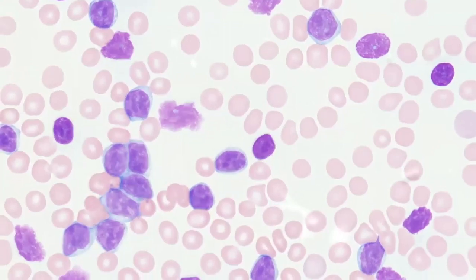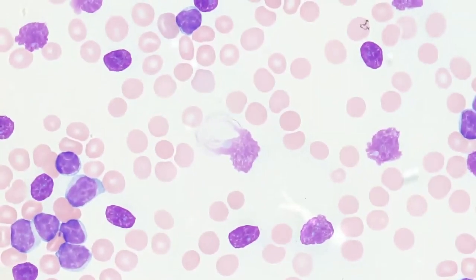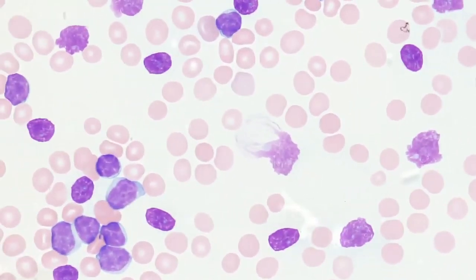As we scan around, you'll notice in the background there are a number of cells that are smudged, or sometimes referred to as basket cells. These cells are produced by the relative fragility of these CLL cells. And this basket cell or smudge cell artifact can be corrected by using an albumin process smear. The albumin helps these cells to stay intact during the process of preparing a peripheral blood morphology smear.